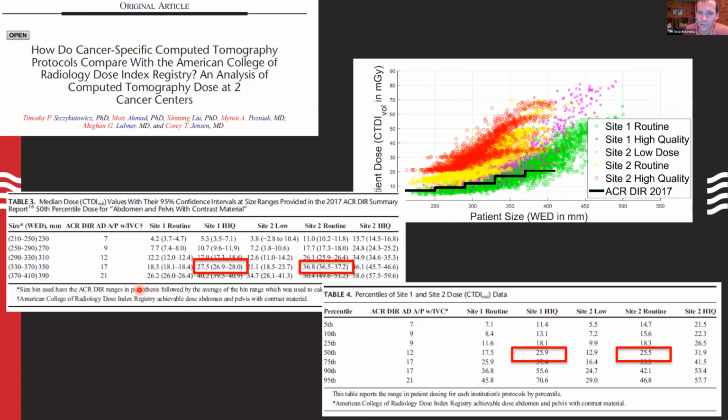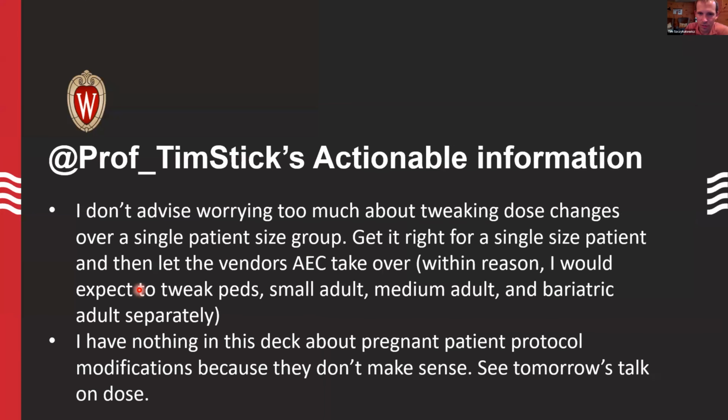So I think this goes into, and I know there are other talks at this symposium on this, regional or personal differences at different institutions, but you definitely should not have all your body indications at one dose level. So basically, I'm making the point that the actual setting of doses between indications needs to be done by radiologist decision.